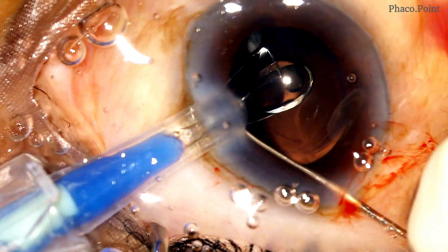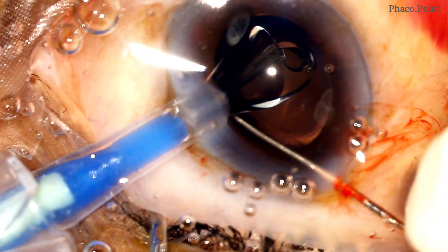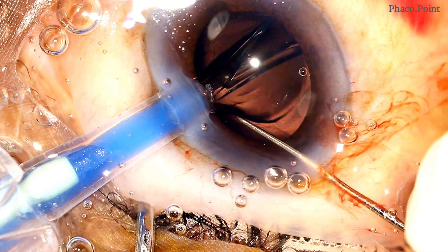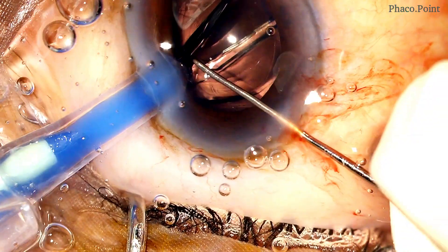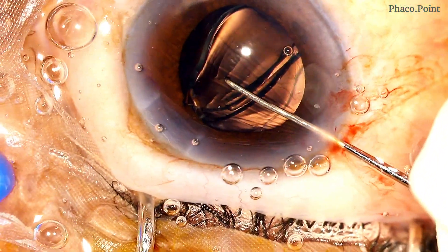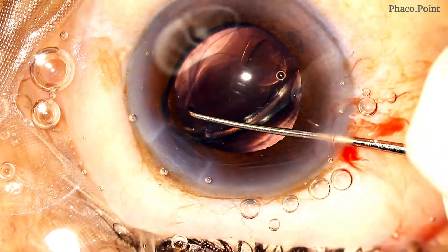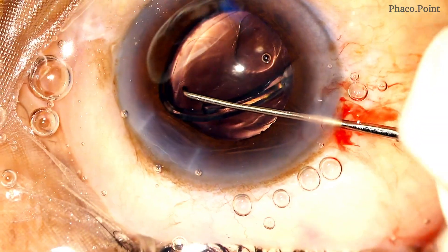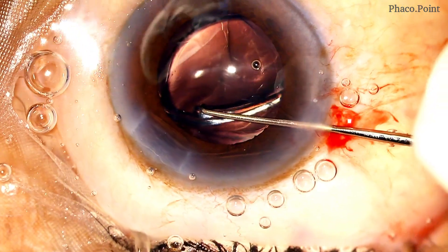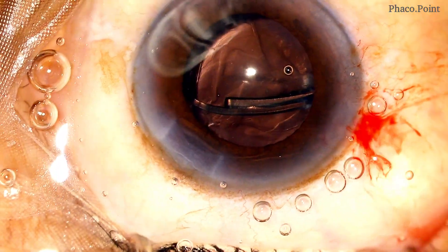With care and caution, the IOL is first injected into the anterior chamber in a slightly downward direction so as to enable the leading haptic to go into the capsular bag. After which, the optic is pushed slightly backwards, allowing the haptics to unfold within the capsular bag.